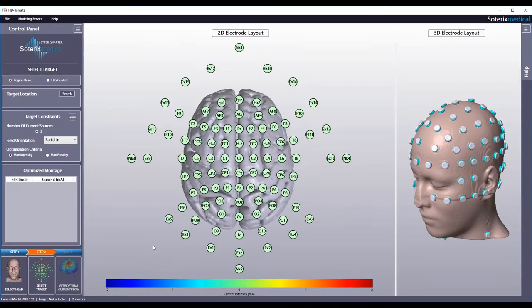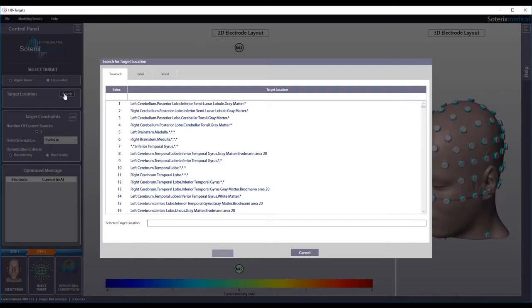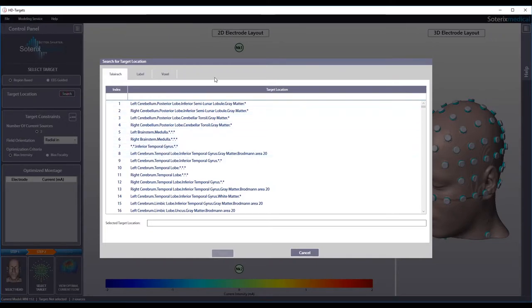In the second step, you can determine the optimized montage, either based by region or guided by EEG. If you select region-based and hit the search button in target location, you will launch a new window with multiple tabs. For Talairach-based targeting, you have 1105 locations to choose from.